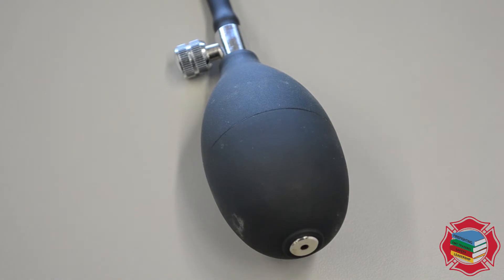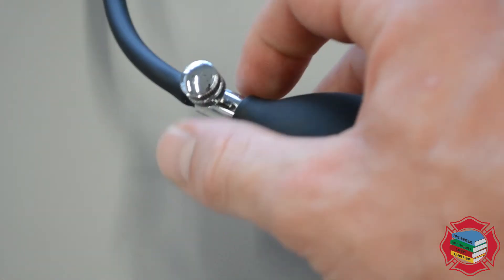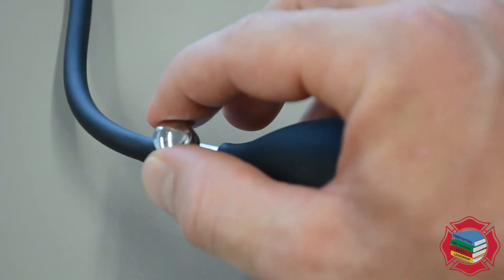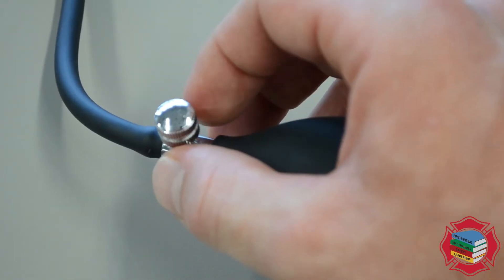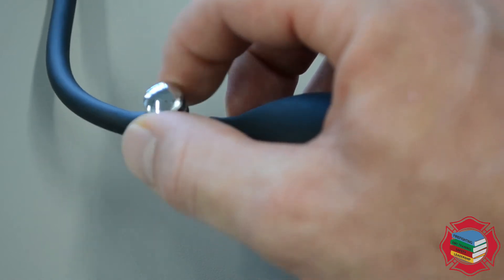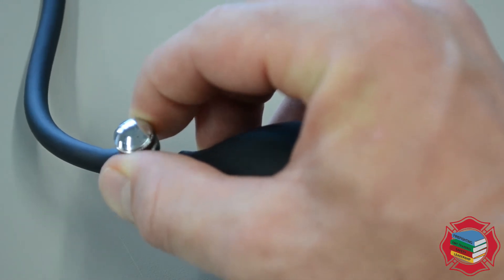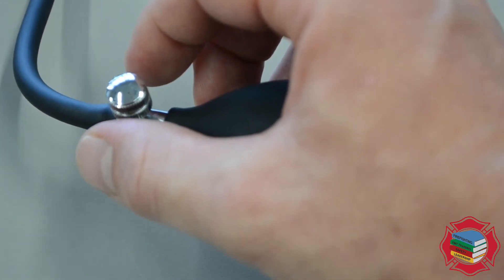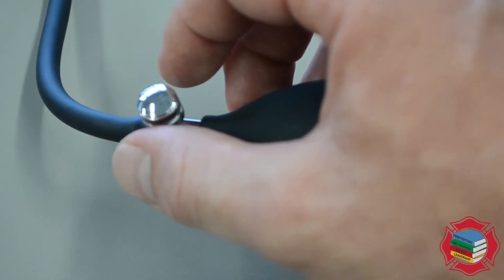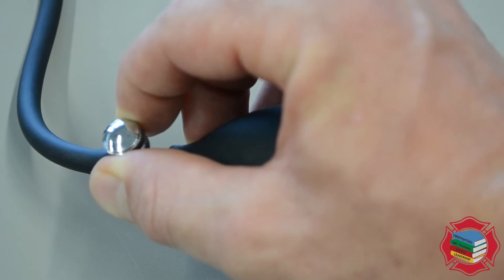Zooming in on the inflation bulb, we see that there is a dial at the top. The proper way to hold this bulb is in your hand with your thumb and forefinger in between the dial, so your thumb and forefinger should have full control of it. Turn it all the way to the right to inflate, and all the way to the left to fully deflate. When obtaining a blood pressure it's important to learn how to control the release of air through this valve in a very slow, controlled manner — your thumb and forefinger must only move the dial a small amount.